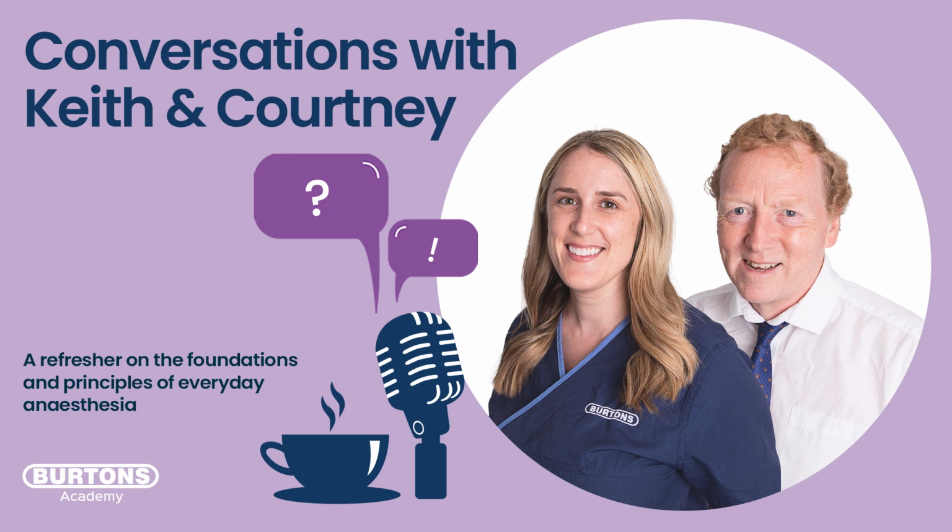But still interesting to know it will concentrate, and it's not the argon itself that's the problem. It's the fact that it displaces the available amount of oxygen to our patient. But you need quite a long period of time and quite a low flow, because our patients are going to be fine with some slightly lower oxygen levels as well. We're not really going to get into a problem until we're less than about 30 or so percent oxygen. But it's interesting, the principle of one gas displacing another, like argon, more or less ignored most of the time, but it could potentially have an effect. So I think it's interesting to know how these things work, because if you understand how they work, then you can understand the effects that they might have.